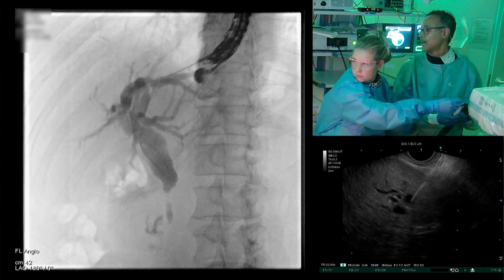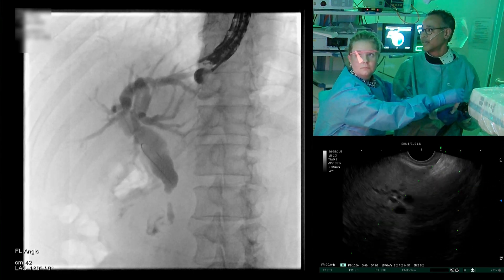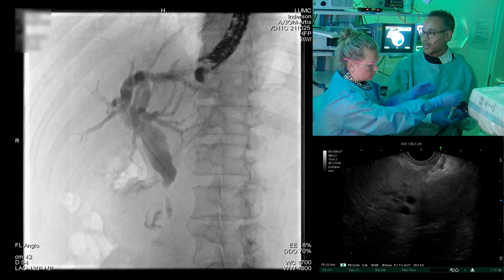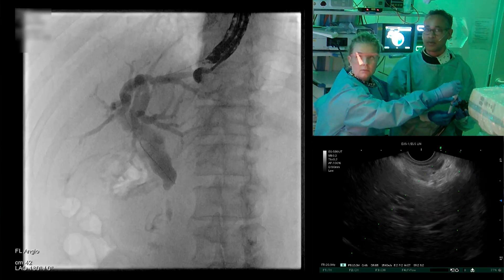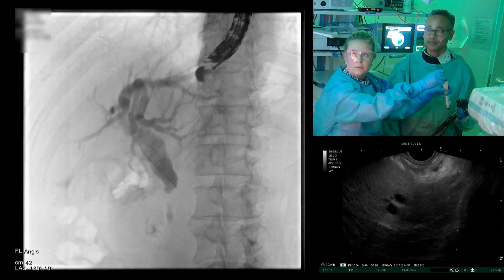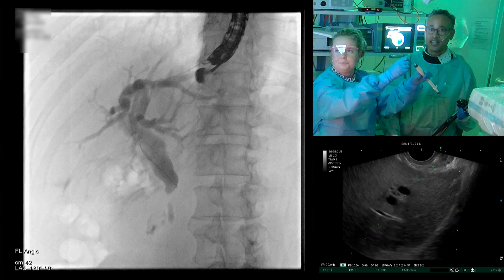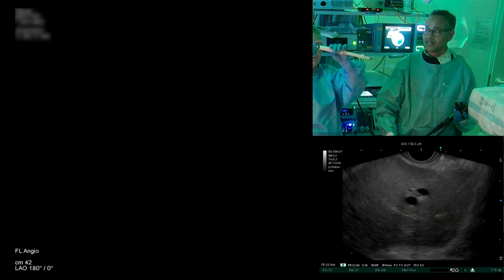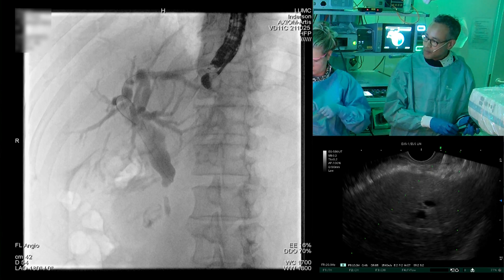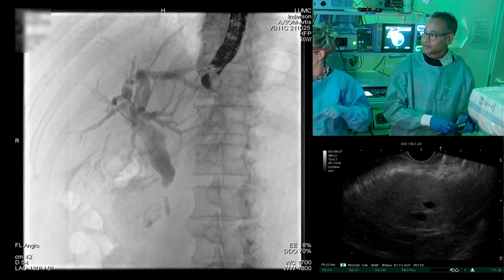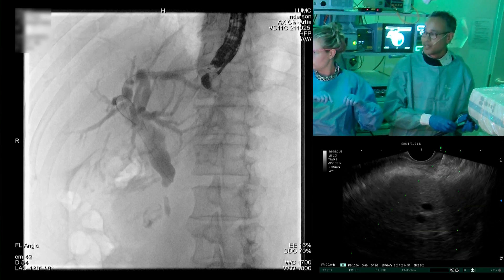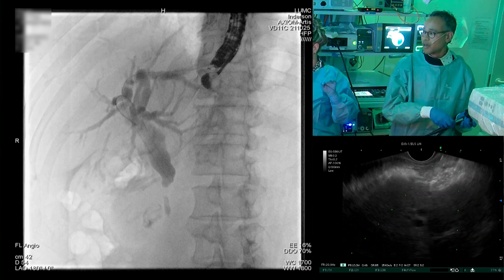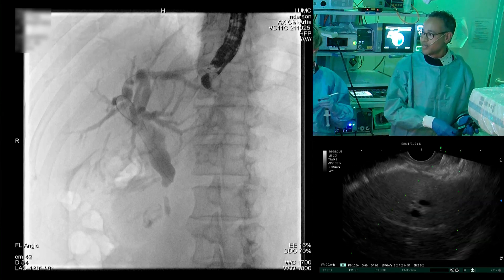I'm going to pull back the needle — you may push the guidewire a little bit further in. We're going to do a long exchange now; this is always a difficult point in the entire procedure, so we're going to use fluoroscopy as well. My endoscopy nurse is exchanging the needle. We're checking that the endoscope and the guidewire stay in place the entire time. We're preparing the 6-French cystotome, which can also serve as a catheter — because if I'm in the liver in the bile ducts, it gives me an anchoring point for the guidewire to hopefully move it past the obstruction into the duodenum.